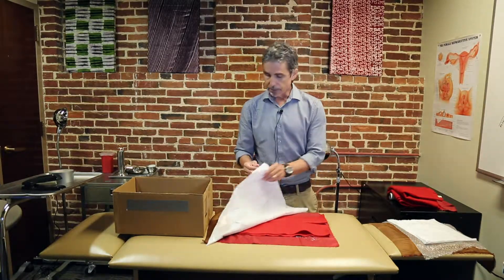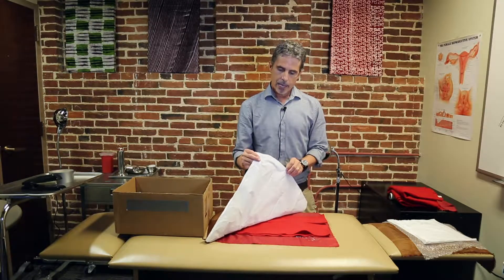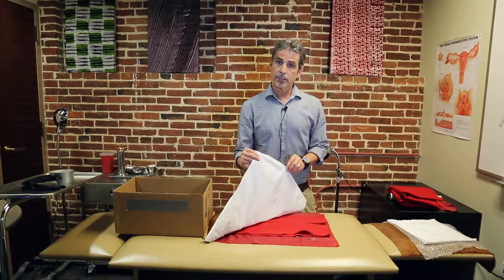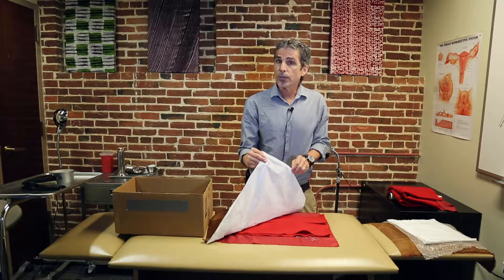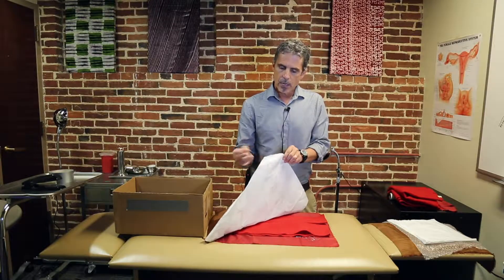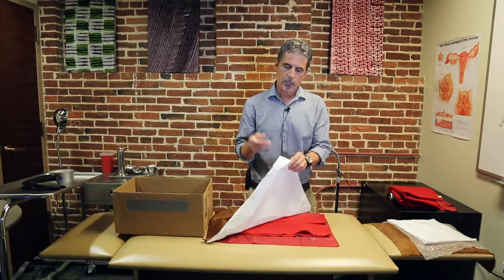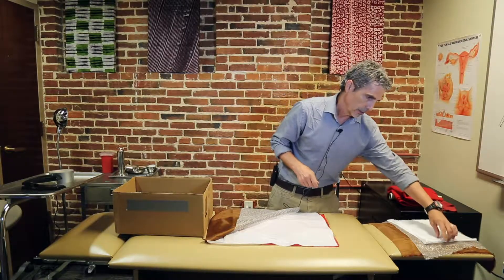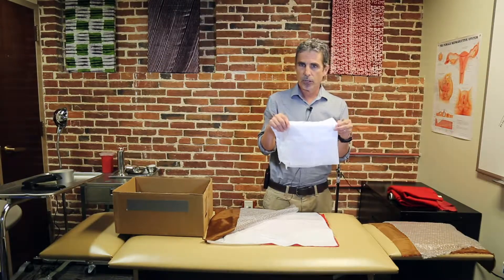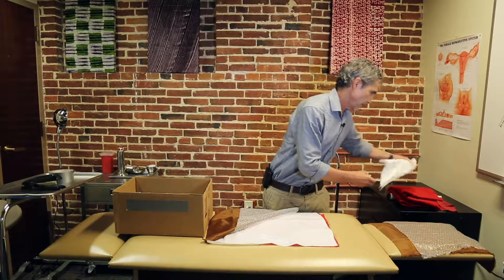The next layer is the fascia layer — a thicker, white material that is not too thick, but thick enough that you have that feel for fascia. You can cut through it, but you can also bluntly dissect it open. You can repurpose white plastic such as potting soil bags or anything along those lines.